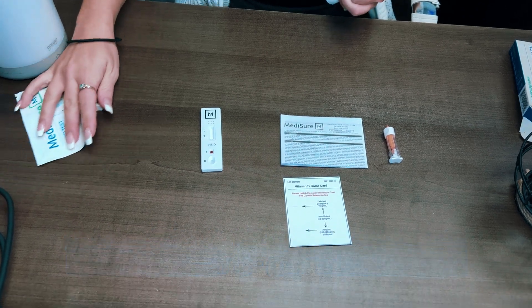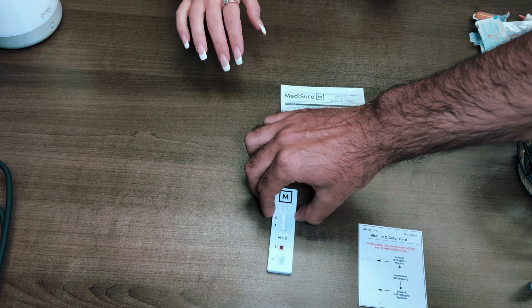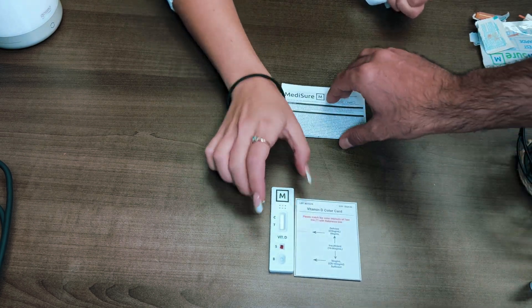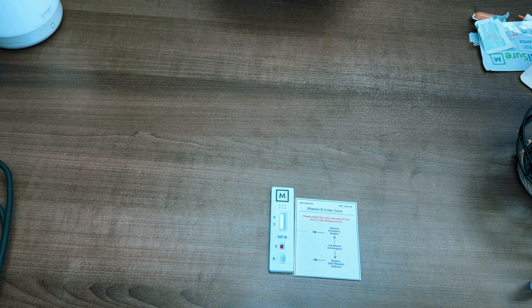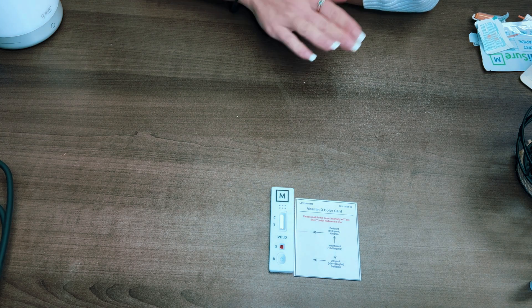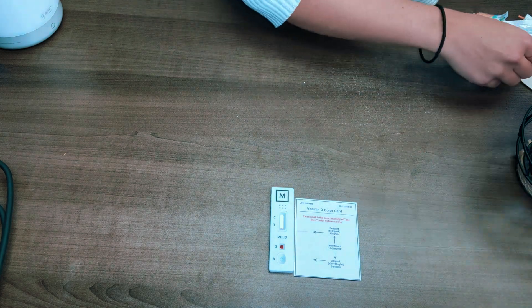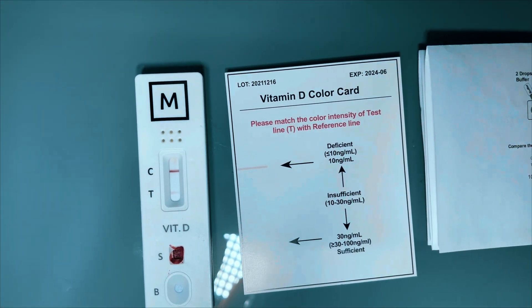Take your results and match them up with the reference color card along with the instruction manual. I know this part can be a little confusing, but focus on the color card and match it to the color and data shown there — that will tell you whether you're deficient, insufficient, or sufficient with your Vitamin D levels.